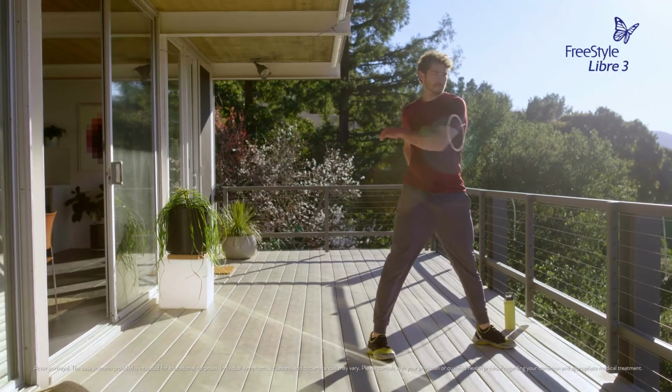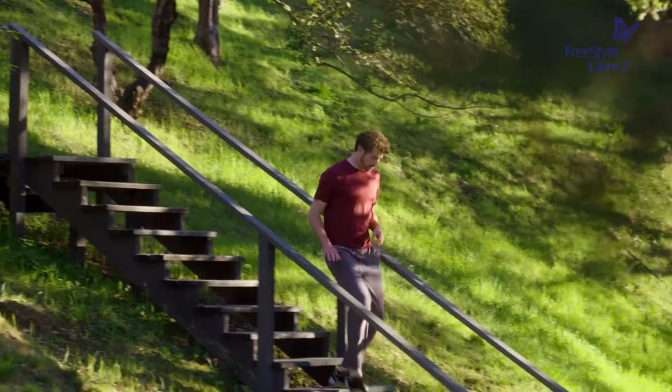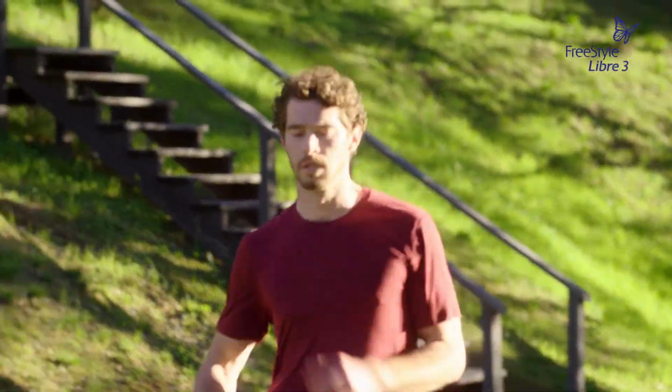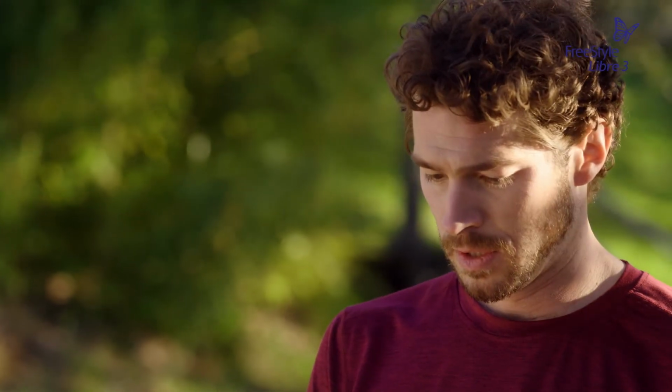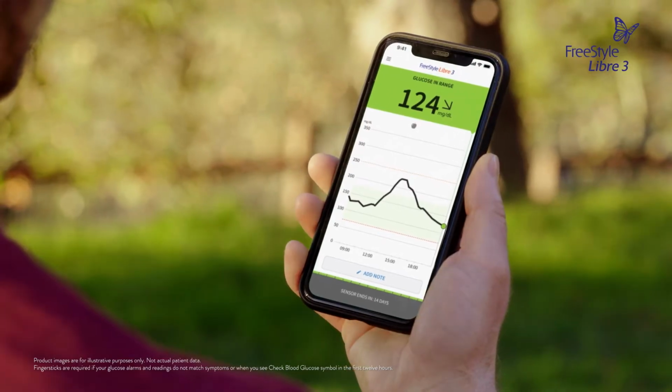I love to go running. It's how I unwind after a full day's work. But sometimes my glucose can drop quickly while I'm out. The FreeStyle Libre 3 system makes it easy to see what's going on with my glucose, so I can stay a step ahead and avoid a low glucose.